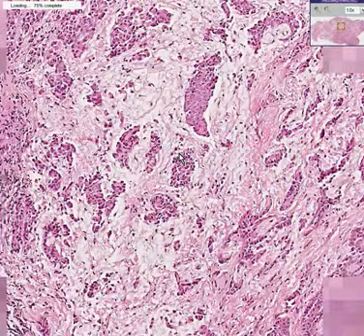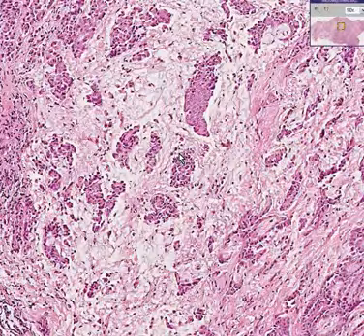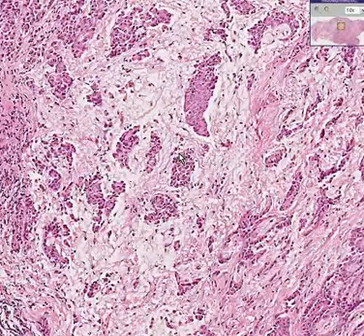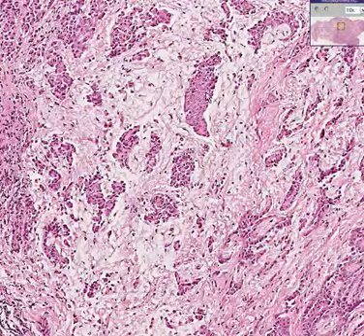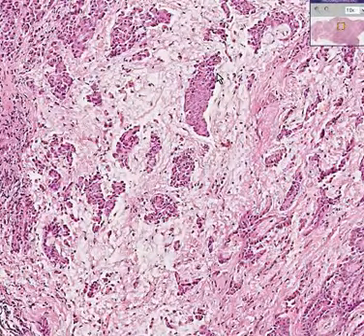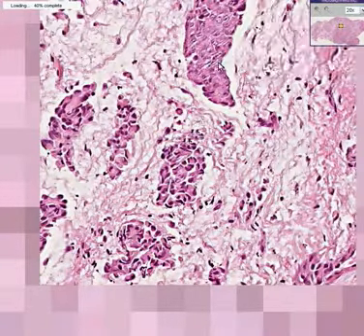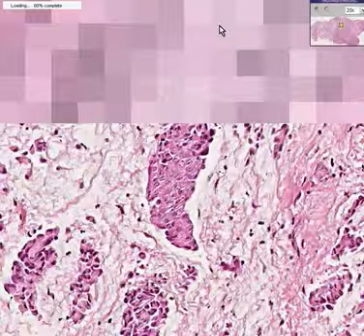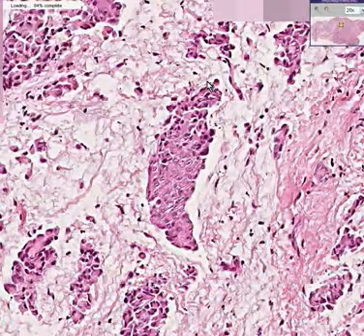Well, to tell you the truth, microscopically you often can't, and you would have to do a battery of stains to differentiate these cells as having a primary mesothelial origin rather than an epithelial origin like you see with squamous cells or adenos. Because quite frankly, on a good day or on a bad day, if you showed this to a pathologist, he could very easily call it metastatic squamous cell, but he'd be wrong, but he'd still be smart.